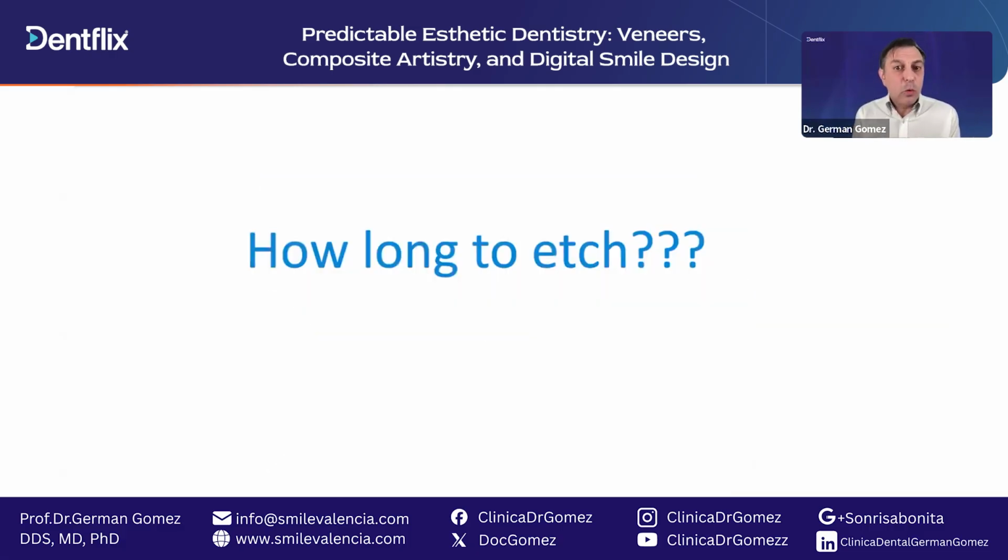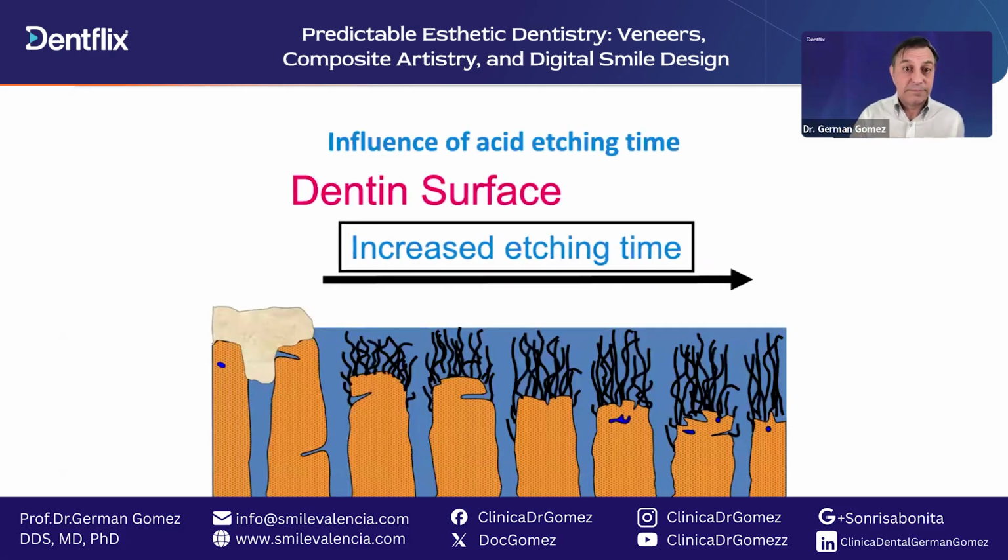So how long do we have to etch? 15 seconds? Yeah, 15 seconds. The problem is, in dentin, if we increase the etching time, okay, if we etch long, then the penetration into the dentin is deeper and deeper and deeper.